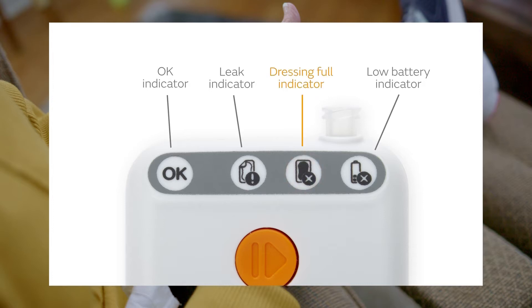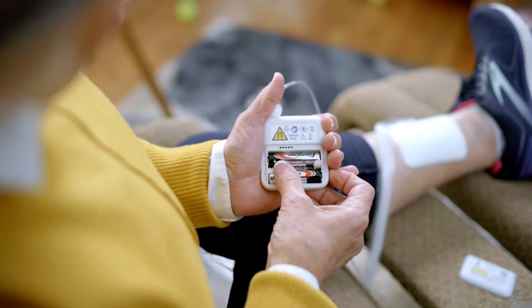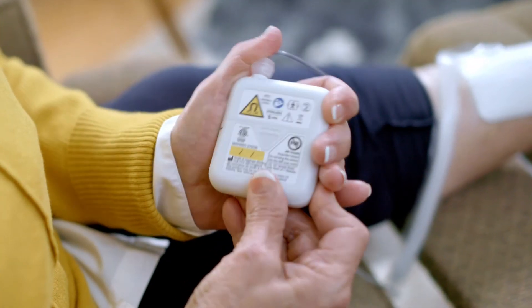The dressing full indicator light on the pump will tell you when your dressing needs to be changed. Note that while you may see some staining on your dressing, you should rely on the dressing full indicator light, the 7-day dressing wear time, or your health care provider's discretion to know when your dressing should be changed. If the low battery indicator light comes on, simply replace the two AA batteries and press the orange button to restart therapy.